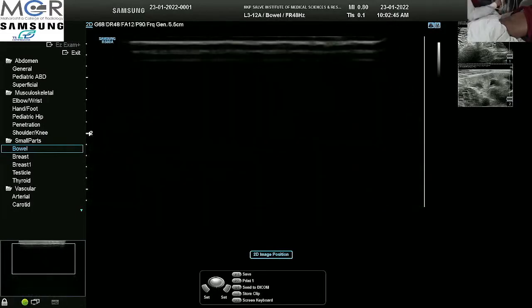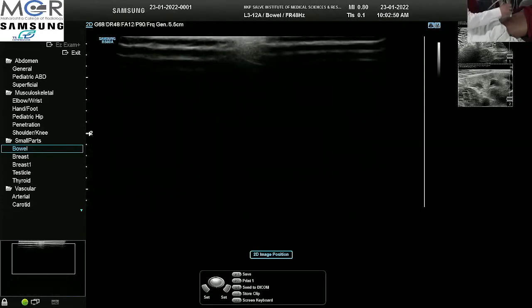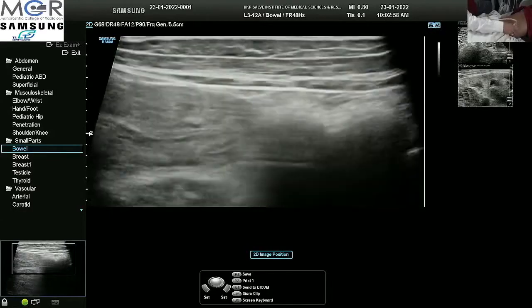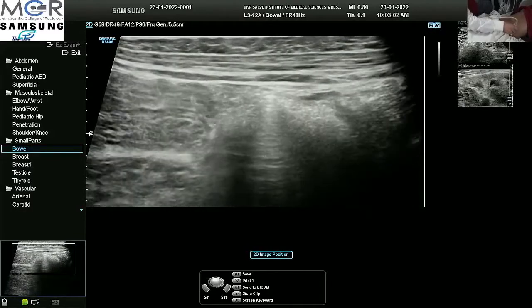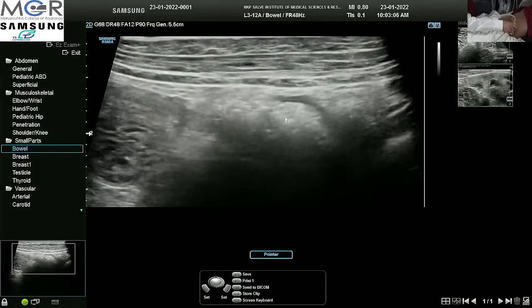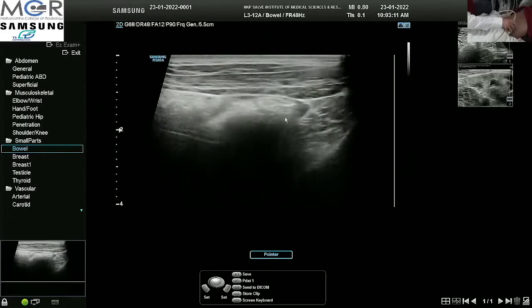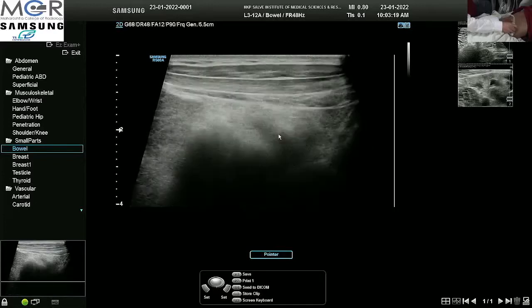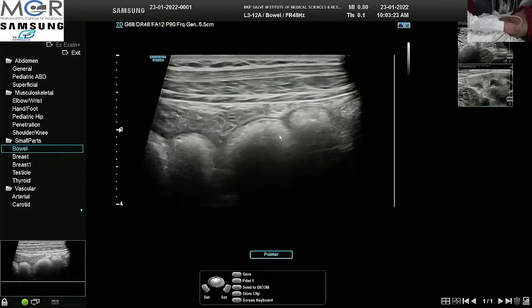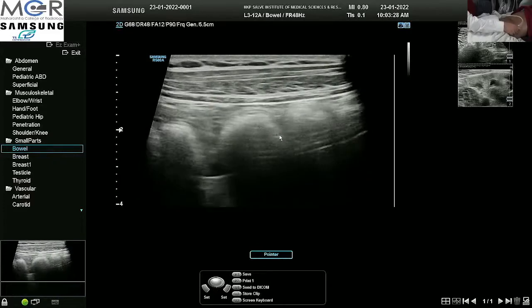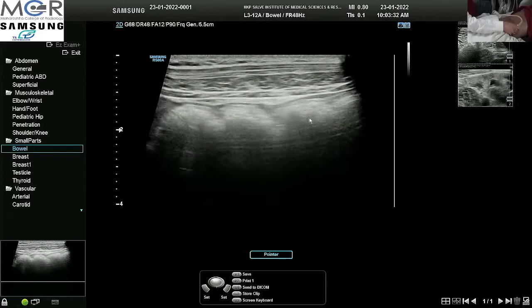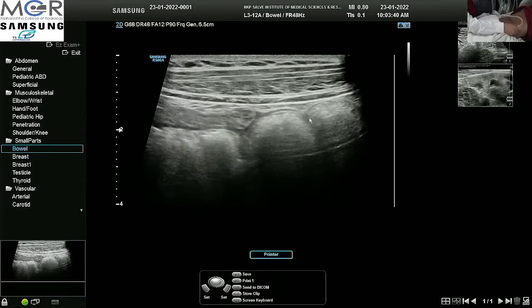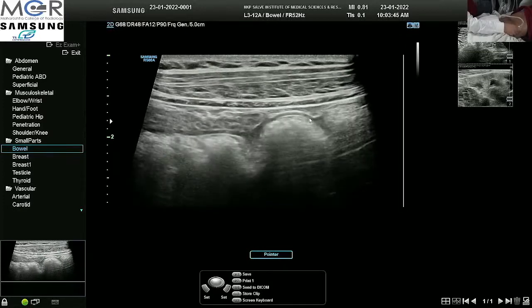After finishing the small bowel, we have to trace the large bowel. The easiest way is to locate the descending colon in the left iliac fossa, which is easily identified by the gas in that region. This is the gas present in the descending colon in the left iliac fossa — the left pubic bone is seen and immediately medial to it is the gas in the descending colon. We can then trace the descending colon upwards and around the abdomen up to the cecum. Since there is a lot of gas and fecal matter within the descending colon, I am not able to see the distal wall, but the near wall is seen clearly along with the haustra.